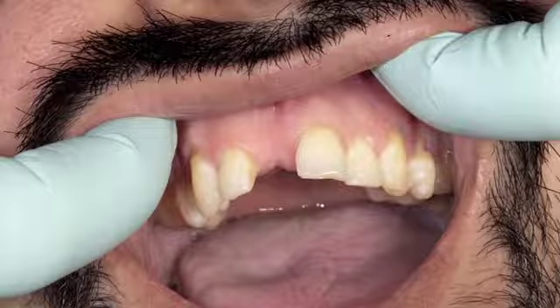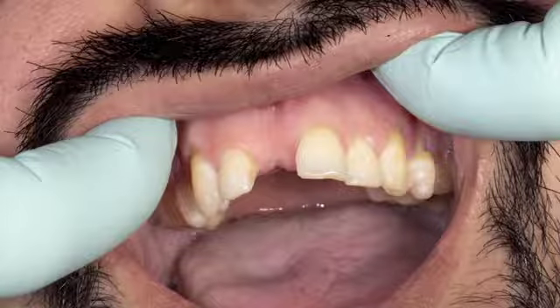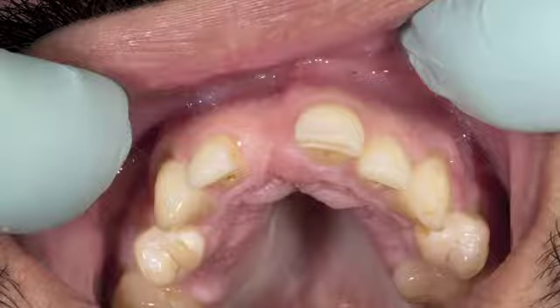The case today involves an anterior tooth, in this case tooth number 8. This patient presented with a history of an extraction of tooth number 8 approximately 15 years ago following trauma, and since that time has been wearing a removable prosthetic flipper to replace tooth number 8. And he is interested in an implant to restore the architecture and the contours of tooth number 8 without the need to have a removable prosthesis.